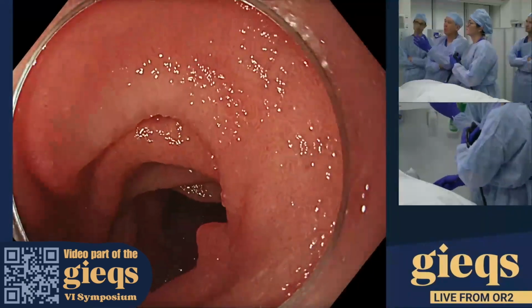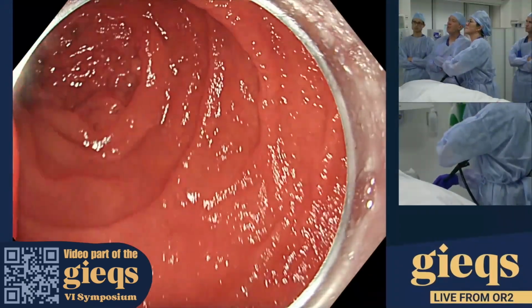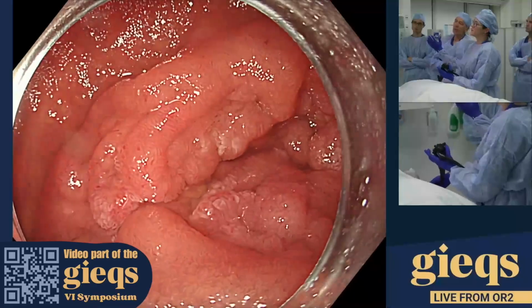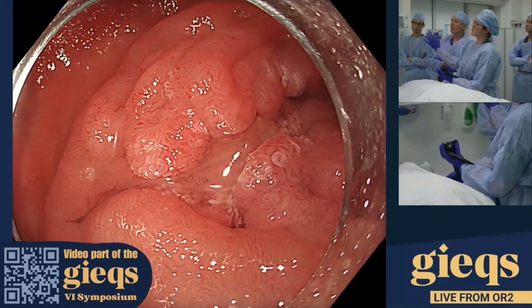So I'd leave a second one where I don't need the whole lesion in place, but I would want to look at the left edge to see how much extension there is going down the duodenum. So this part here, yeah. To know, right? So in 2 photographs, I've got an overview of the whole lesion, David.